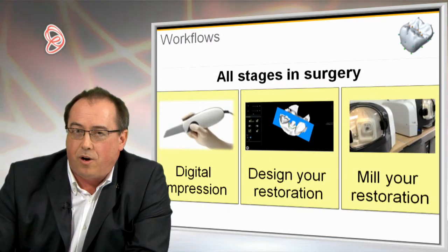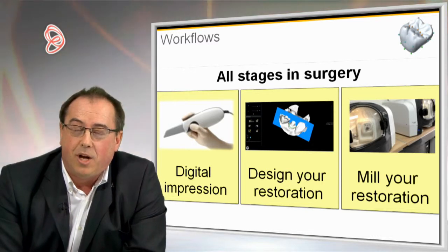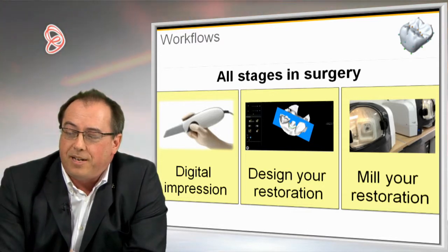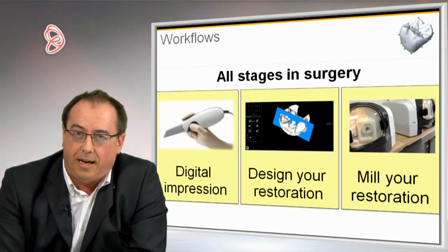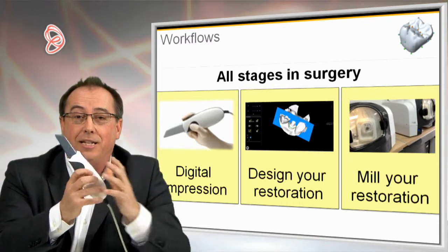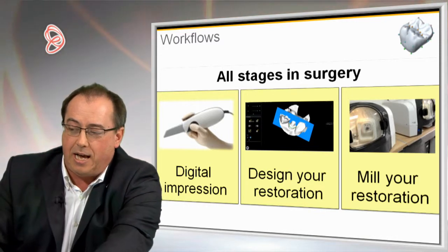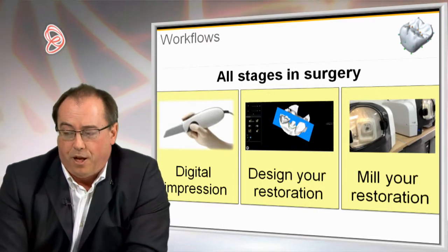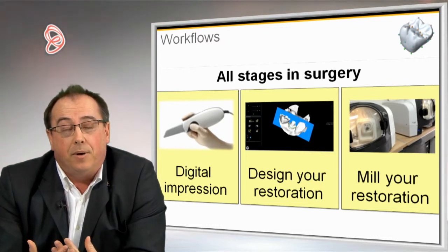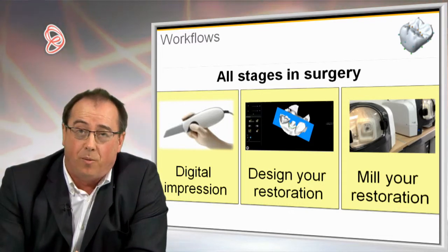So stages. For where I am now, I'm going to try and talk to you as a dental technician, but I am employed by Carestream, so sometimes I will veer into Carestream products, but I'm trying to keep as neutral as I can. We have two workflows here. We have a digital camera, which is out of shot now. Hopefully you can see that. That's our digital impression camera, and it can go in two directions. As this slide shows, in 3 steps: you take a digital impression, you as a clinician design your restoration, and then you mill your restoration in a chairside mill machine.